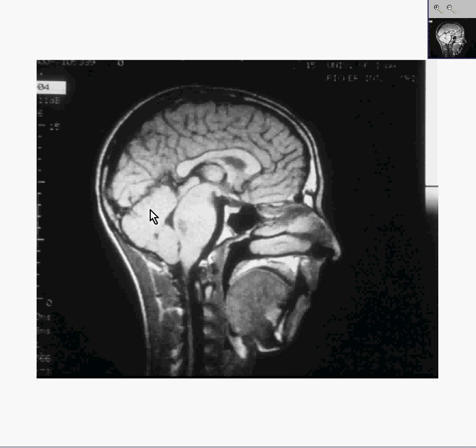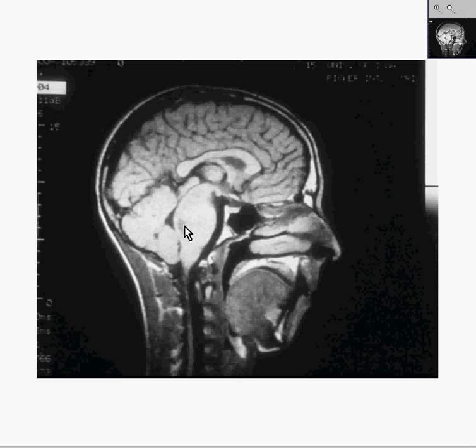Cerebellum looks pretty good. Corpus callosum looks pretty good. The general pons-midbrain area, however, is not only sort of enlarged, but you can start to see some irregular signals on MRI right here, and perhaps lesser up here.